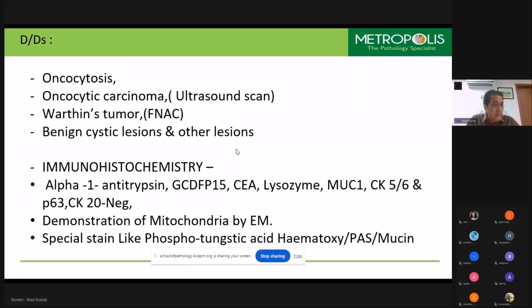So that's one of the things, when I look probably in an FNAC, which I'll come to later when I talk about Warthin tumor, you may mistake it for squamous cell carcinoma. Okay, that's very important. When you're doing FNAC, you must be very careful.